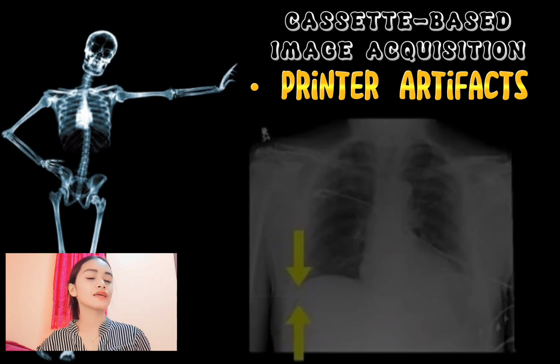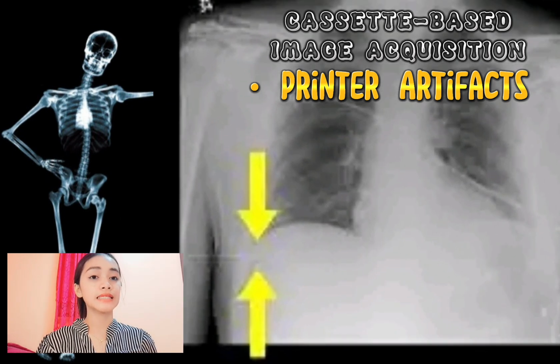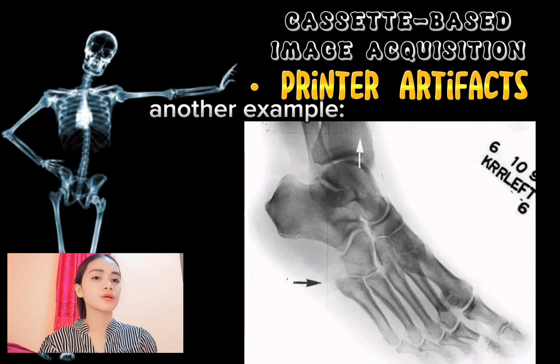So, this is what it looks like. This is the white lines. So, this oblique foot image demonstrates two different artifacts.